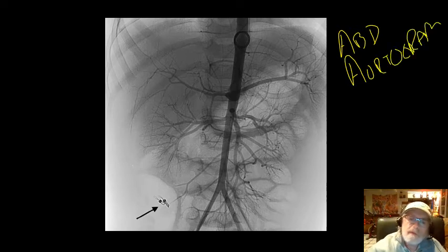So now they put the dye in there. You can see the catheter, the catheter loop. Here's actually the catheter. You see it down in here, coming down here. It's going actually down through here. Most times what they do is they put it into the right femoral artery, just a little bit at the top of the leg, right below that inguinal crease or that ligament where the crease is at the top of the leg. And what they've done is, you can see an intercostal artery here.